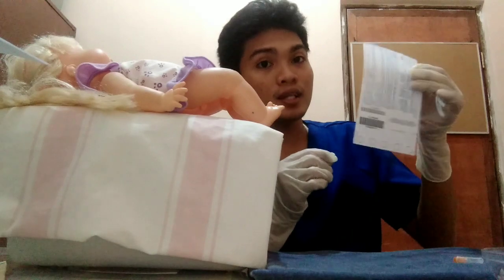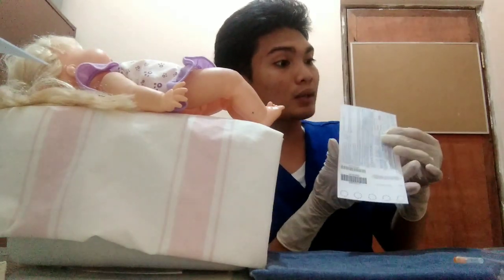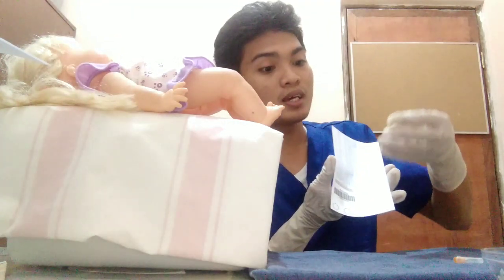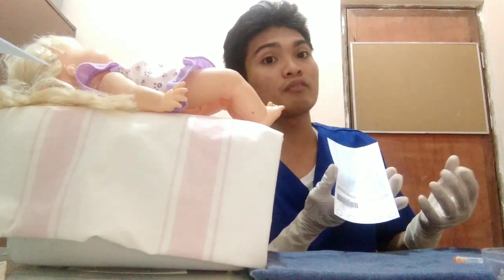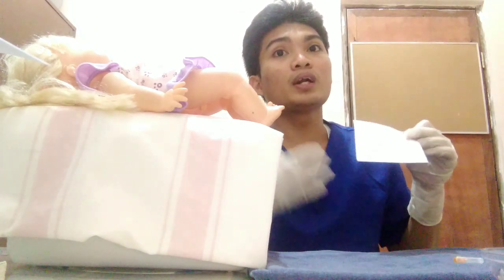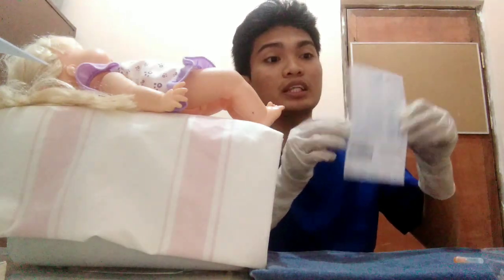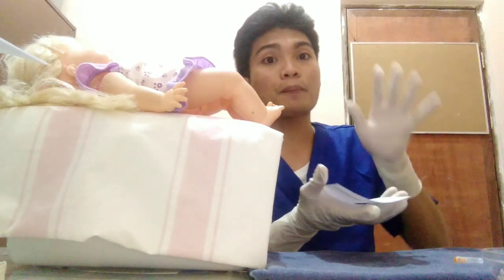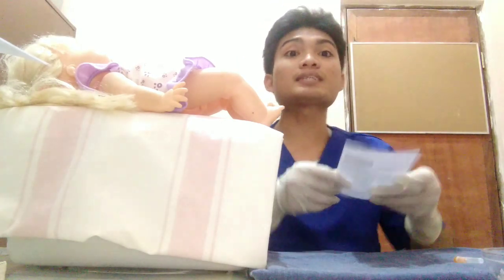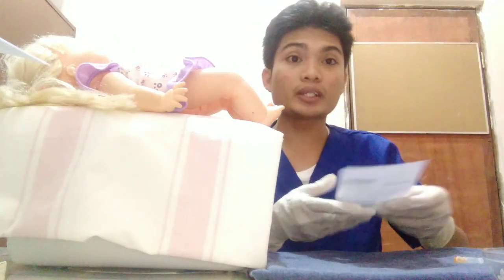So once na na-contaminate siya, there is a possibility that microorganisms such as bacteria and parasites will be flourishing on the blood and might screw the results and might create false positive results of the baby. So it is better talaga na we will be handling the filter paper with blood with our care. So this should not be stocked. Hindi siya pwedeng pagpatung-patungin habang hindi pa siya tuyo. Hindi siya pwedeng ilagay sa envelope na isisend doon sa na ibibigay sa courier na hindi pa siya tuyo.